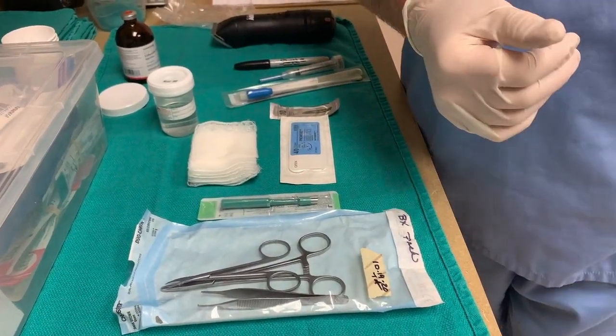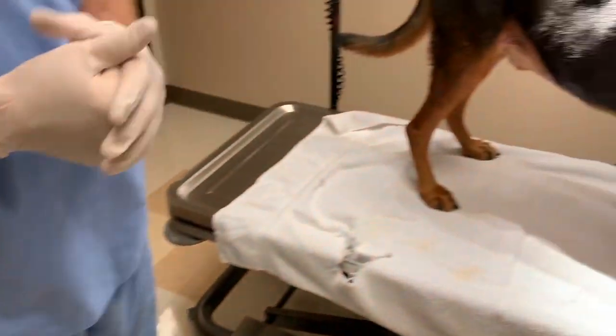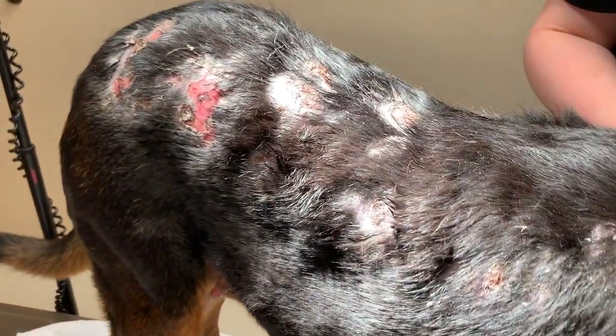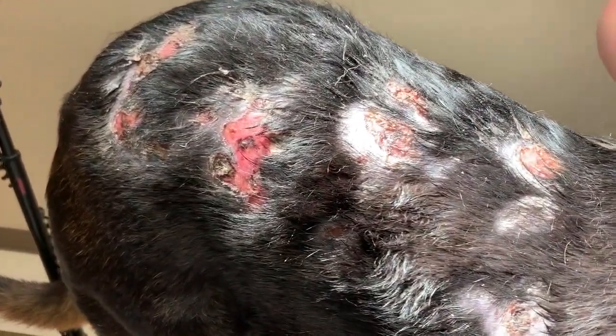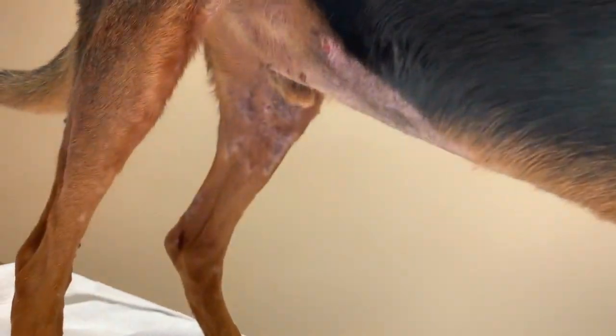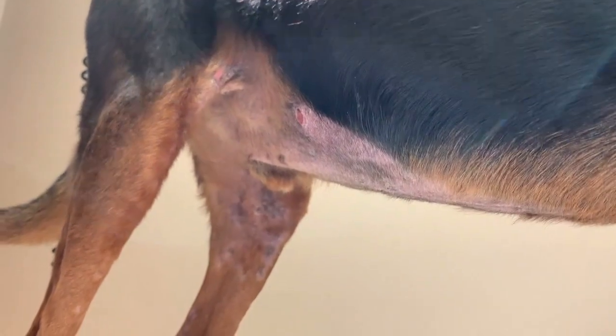So here's our patient. Rudy has these ulcerative crusted lesions that could be panniculitis or could be an autoimmune skin disease, so we need to get some biopsies of this and we'll need to select some sites in order to get some diagnostic samples.